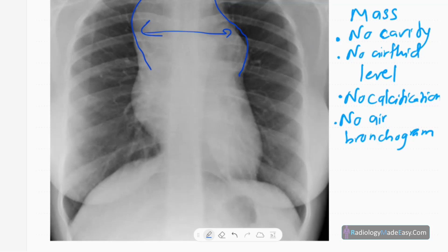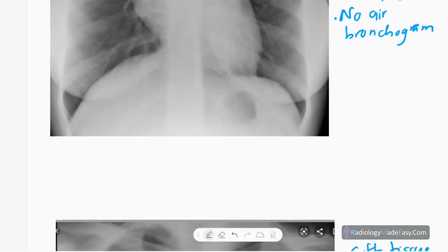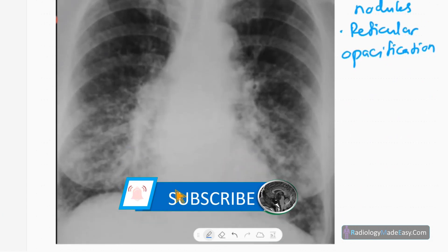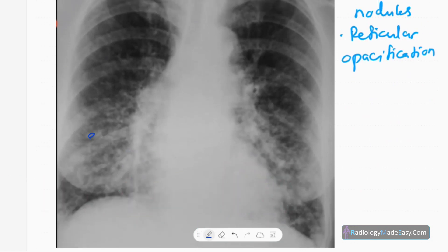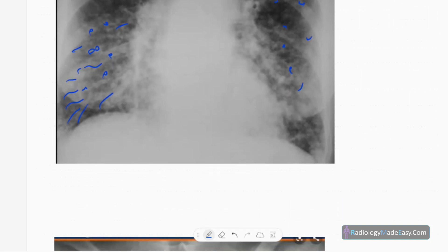In the next chest X-ray, you can see reticular nodular opacifications — small nodules of tissue density, mainly distributed in the lower zones bilaterally. You can also see some reticular markings. This is another presentation of lymphoma with lung parenchymal involvement: reticular nodular opacifications.